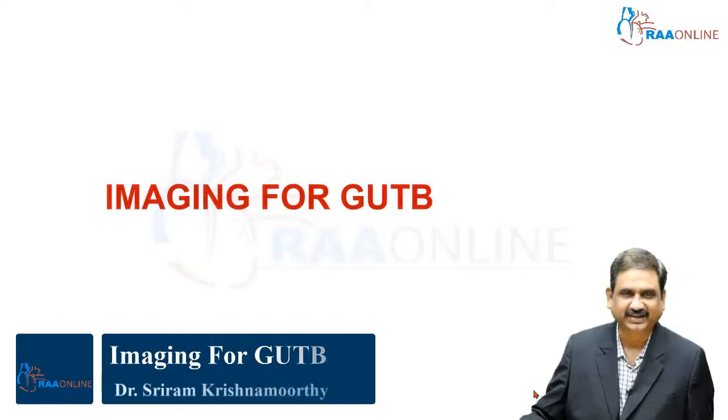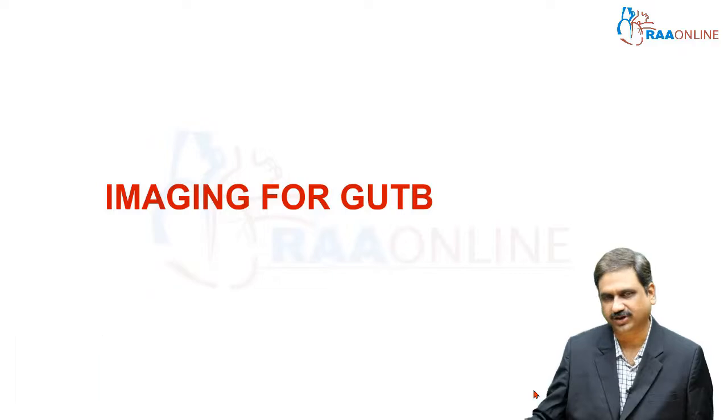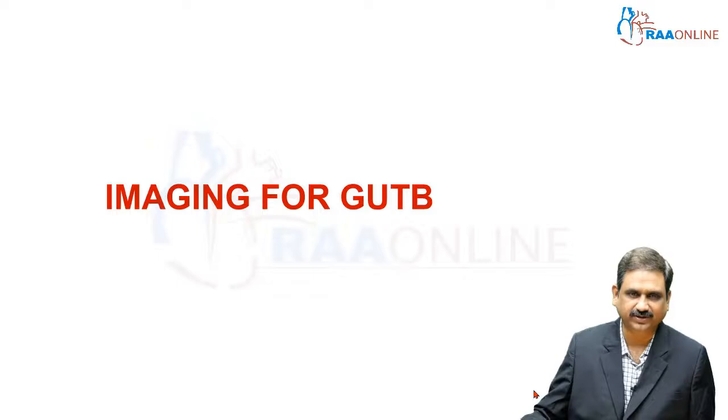Okay, so the next important subtopic of GUTB that we are going to discuss now is the role of imaging in genitourinary tuberculosis. So by imaging we mean what exactly the mode of diagnosis is going to be. Earlier we discussed the biochemical and the urine culture methods of diagnosis. Now we are going to discuss the radiological imaging of genitourinary tuberculosis. How exactly you can make a diagnosis of GUTB by the use of ultrasonogram, by the use of intravenous urogram, the CT scan and the MRI. So that is what we are going to discuss now.